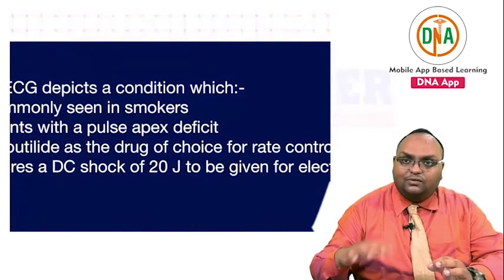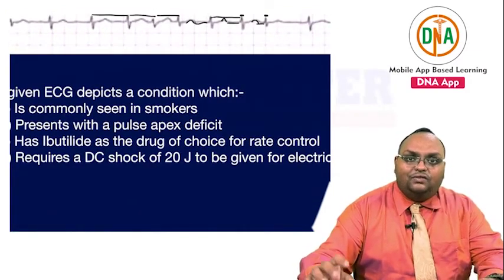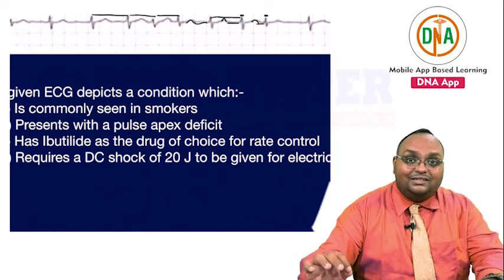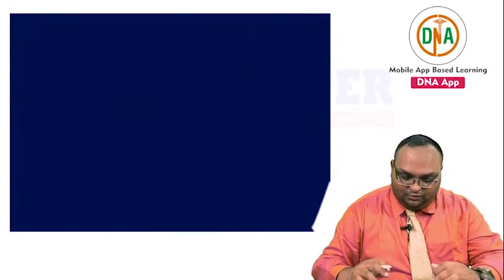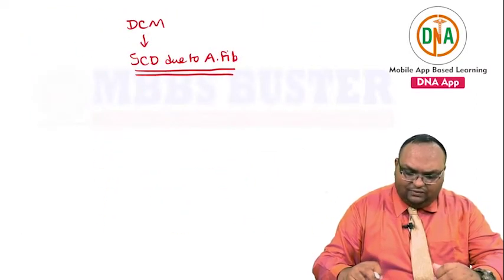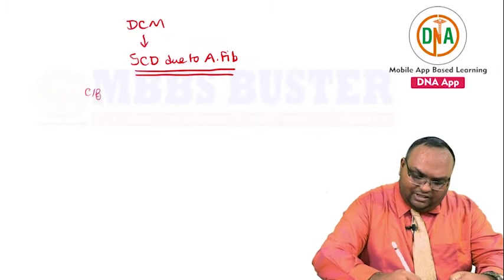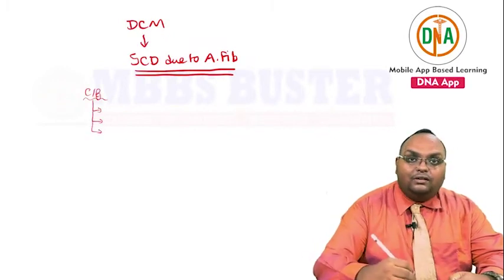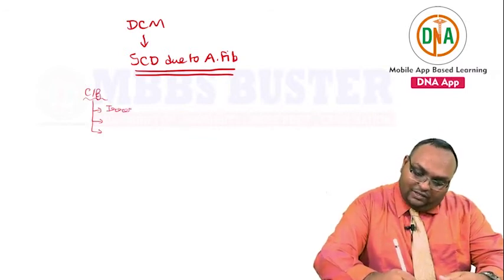Right now we are more concerned with atrial fibrillation, and apart from the fact that in atrial fibrillation you have these characteristic ECG findings, I would also be interested in discussing with you some of the clinical features of atrial fibrillation. There's basically a bedside triad by which you can define it or diagnose it. You have irregularly irregular pulse.